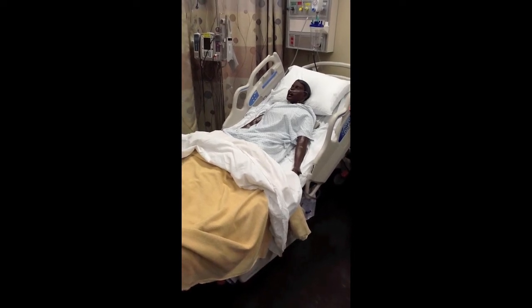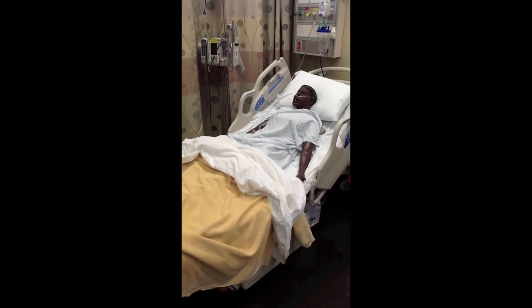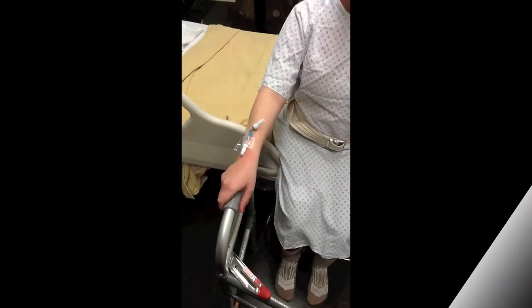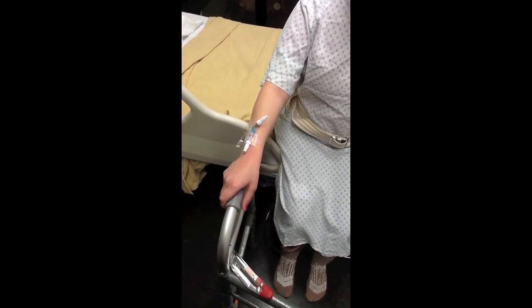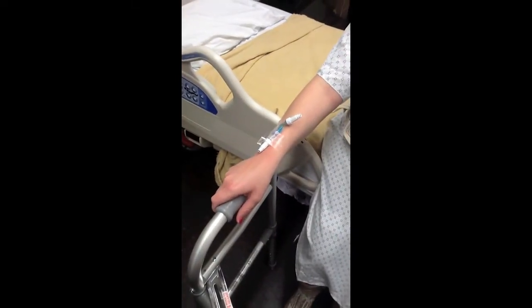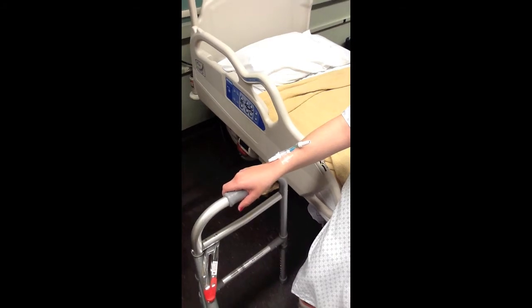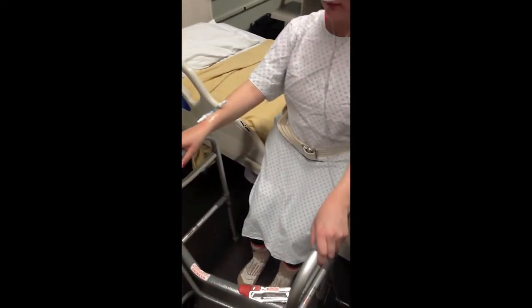If at all possible, you should limit tethers by talking to the nurse and asking if certain tethers could be disconnected for the time of the walk. Communication is key before ambulating a patient. Try to limit the number of tethers by talking to the nurse and seeing which tethers could be disconnected during the time of ambulation. Usually, a saline lock could be applied to an IV for a temporary disconnect. You can also shut off feeding tubes for the time being.